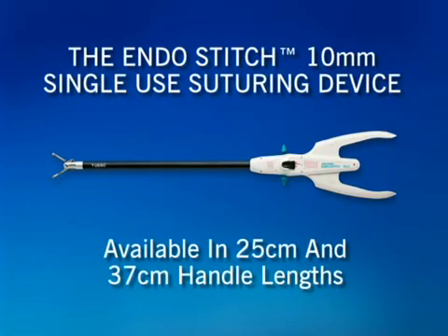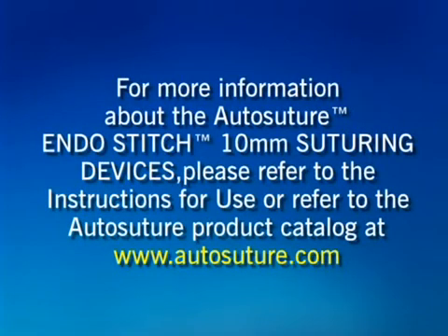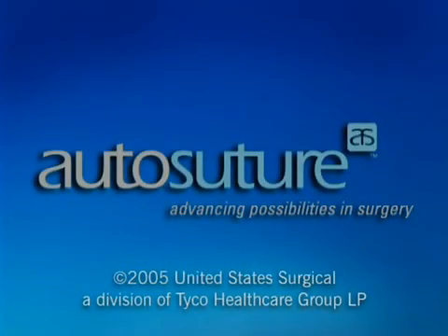The AutoSuture EndoStitch suturing device comes in two handle lengths: 25 cm and 37 cm. There are a total of 32 suture cartridge reloads that are combinations of two lengths, four suture sizes, and four suture materials. For more information, please refer to the instructions for use or the AutoSuture product catalog at www.autosuture.com.